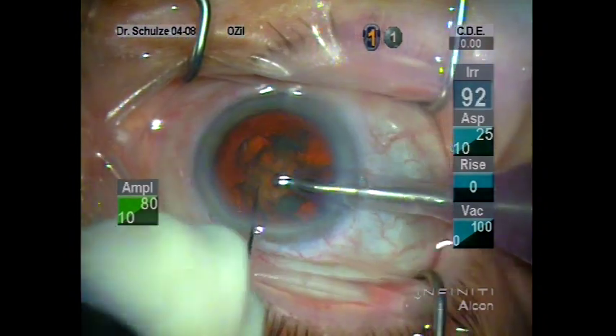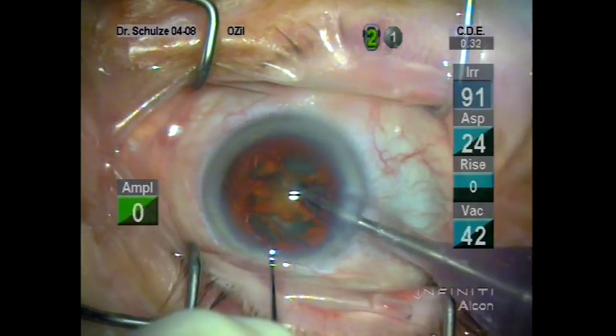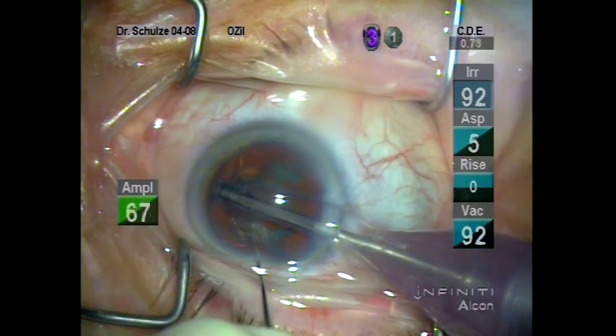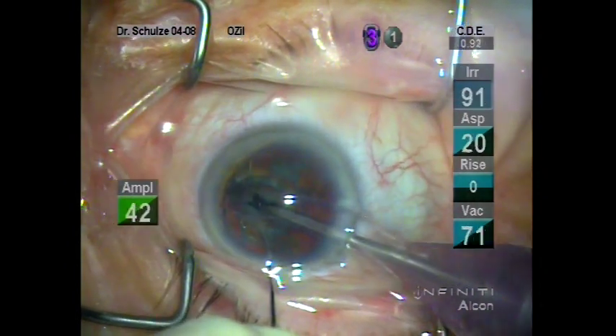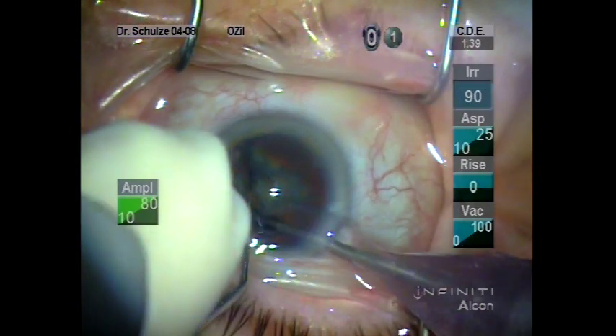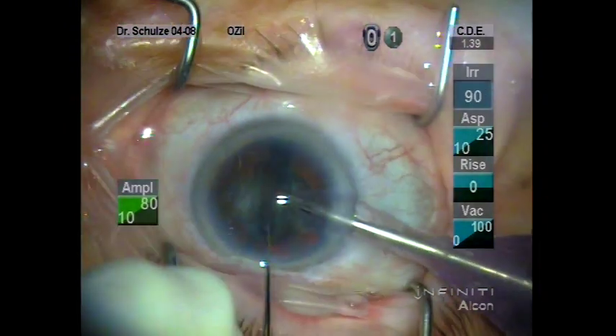The settings on the FACO unit for sculpting: the minimum of the aspiration is 10, the maximum is 25, and likewise with torsional power, the minimum is 10 and the maximum is 80. This just helps things move along a little more expeditiously as I engage the foot pedal in positions 2 and 3.